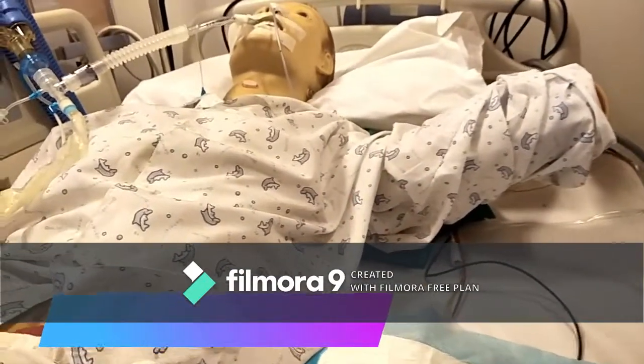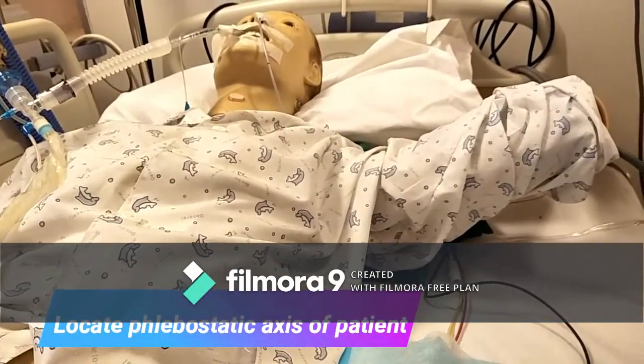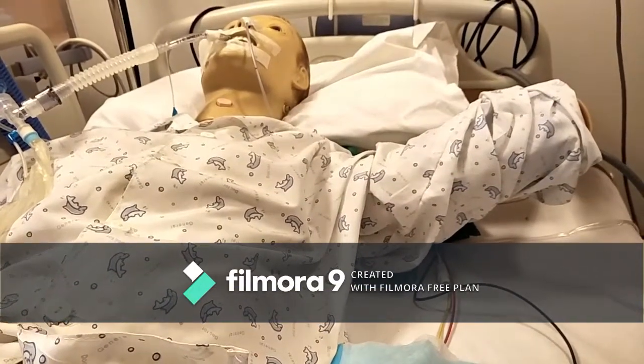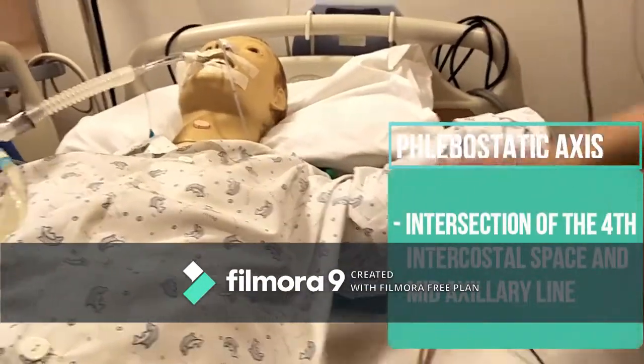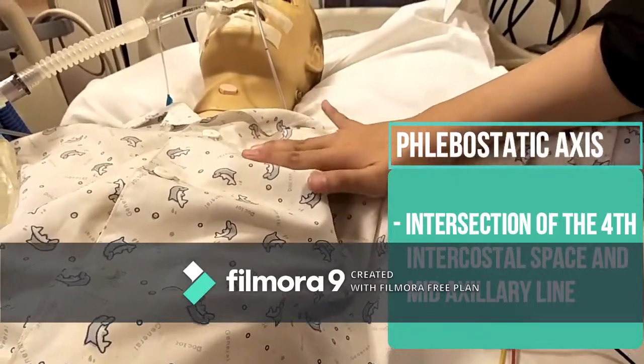Locate the phlebostatic axis on the patient, which is the point on the chest that represents the position of the atria and therefore reflects central blood pressure. The phlebostatic axis is located at the intersection of the fourth intercostal space and mid-axillary line.